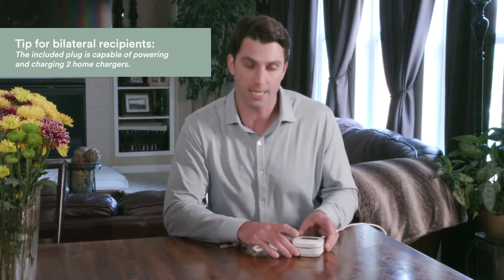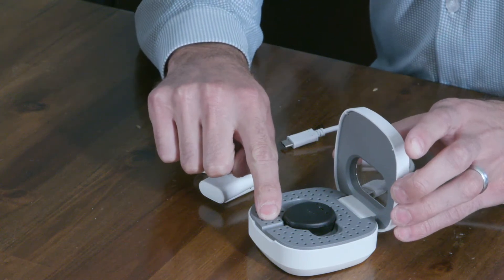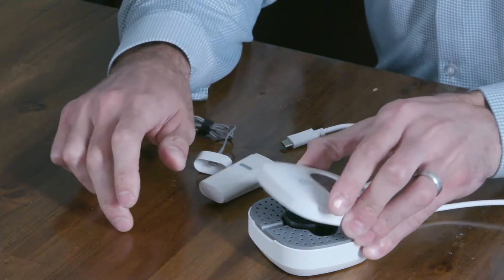The light will turn a steady green when it's complete. If you are using a retention line on your Kanzo 2 sound processor, the little space here on the front of the home charger allows you to do so with the retention line still attached.